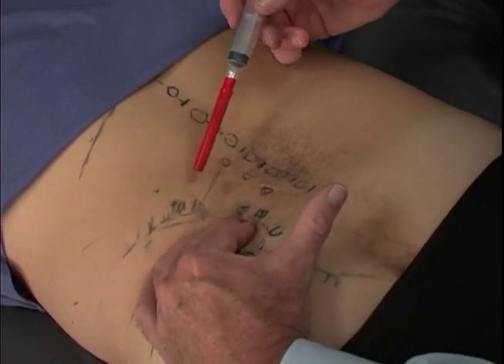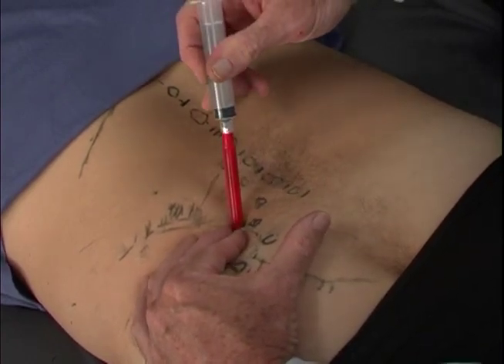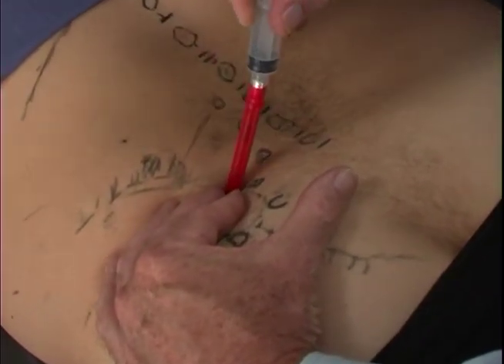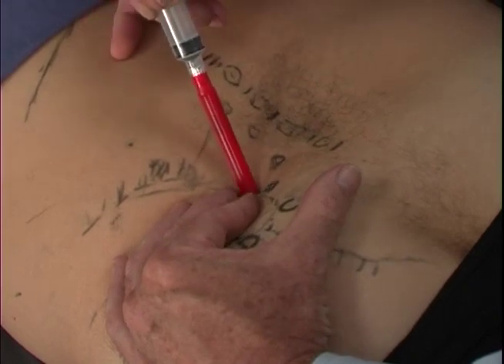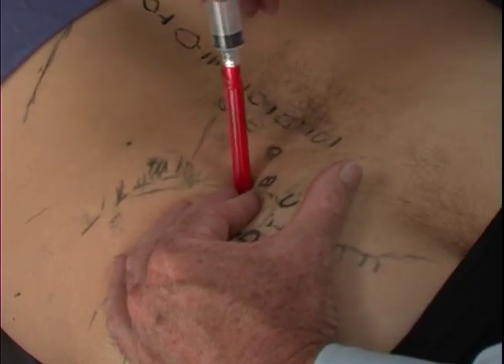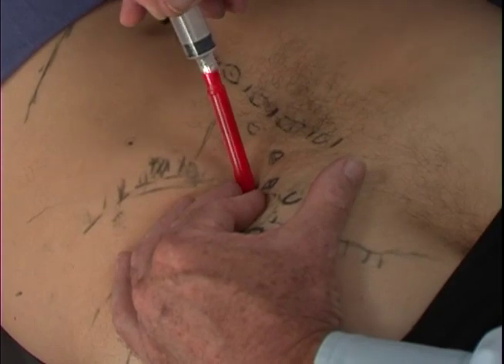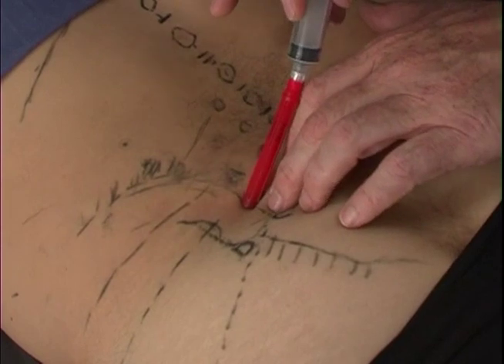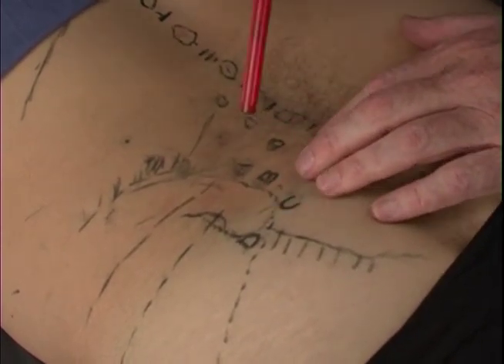We can roll our fingers over the edge, and then with skin compression, come in and find the edge of the ilium and hit it, and then walk with needle orientation, coming out to the skin and then back in again, walking 2 or 3 times with each injection along that ilium, and then sliding off and going deeper into the deeper cleft between the ilium and the sacrum to get the deeper fibers of the posterior sacroiliac ligament at areas A, B, and C.